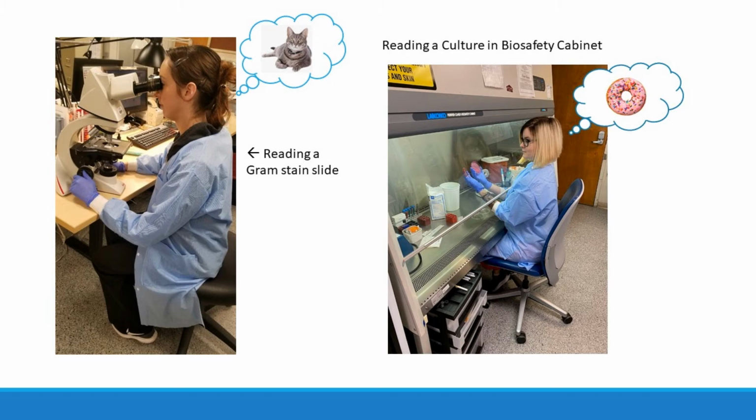So for blood cultures, it's important to note, obviously we need to collect them before antibiotics are given. We need at least 8 to 10 mils per blood bottle. And for children, it does depend on their weight. If you cannot collect that 8 to 10 mils per bottle, please fill the aerobic, the blue top container first, and then put the remainder in the anaerobic. So don't split half and half. Put most of what you have in that blue top. If you don't have enough for the anaerobic, you don't, but we need that aerobic filled completely. And I'll explain why here.